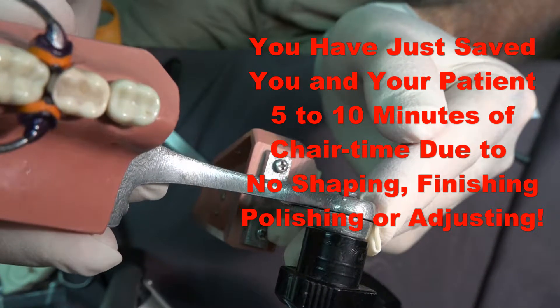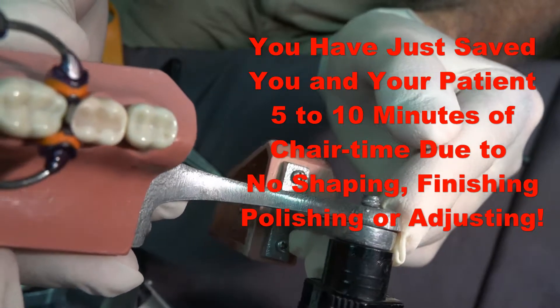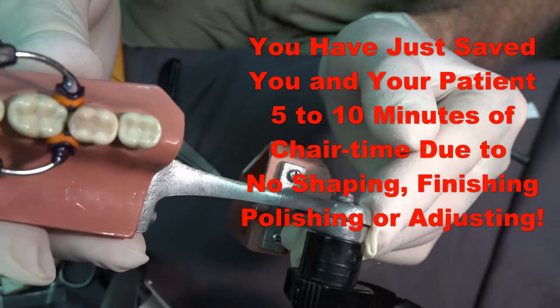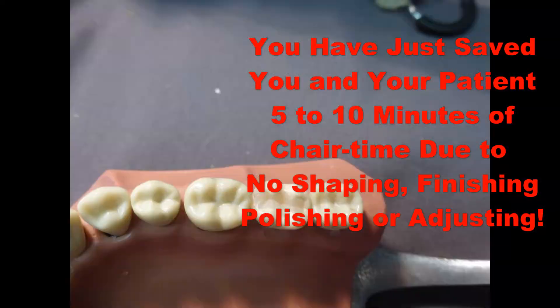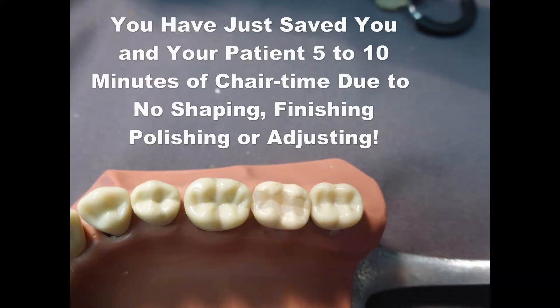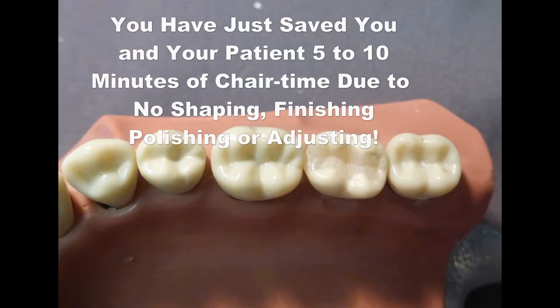Yes, I know it's hard to believe. When was the last time you placed a large posterior composite and, after light curing, there was no shaping, finishing, polishing, or adjusting? You will save five to ten minutes on every composite that you place with this technique.